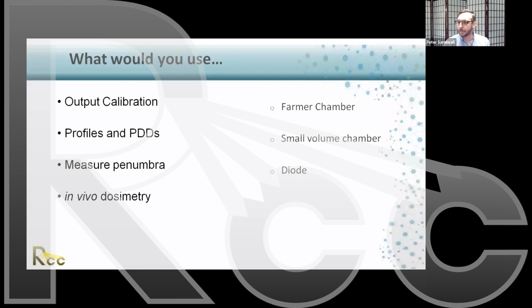What about in vivo dosimetry? What would we use for in vivo? You can use the GAFchromic. That takes some practice. This is good. And MOSFETs. Oh, I see MOSFETs. Semiconductors. Very cool. And those are really, really small. They just have a lifetime. We're not covering them today, but they're cool. What about end-to-end testing? TLD, GAFchromic, pinpoint, film, gels, detector arrays, and combinations using multiple detector elements. 100%. So thank you for participating in this checkpoint.